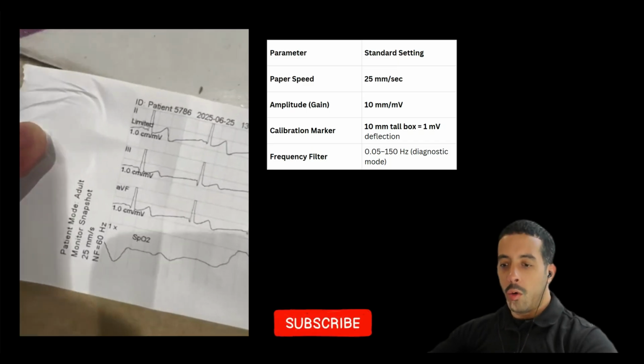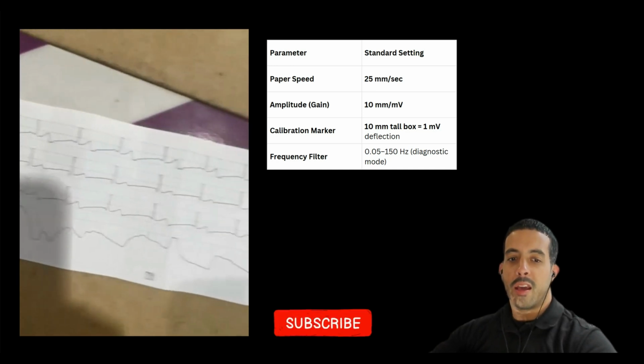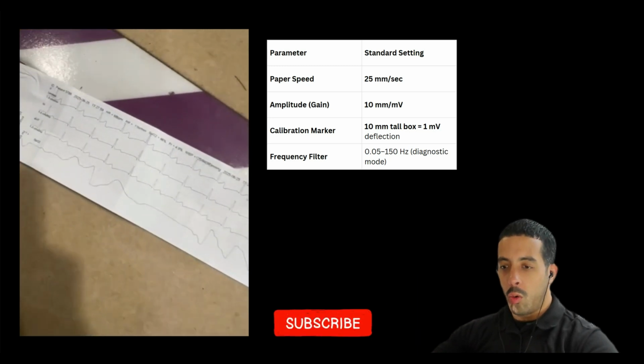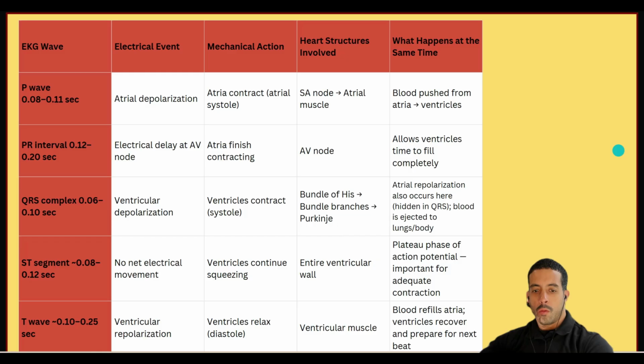Now, here's a video of an actual printout from an EKG. When you print out EKGs, make sure you reference this table on top of me so that you know exactly the calibration a monitor should be on to be considered accurate. All right, my people, I've created this table for you so that you can see that on EKG paper, there are many things going on simultaneously. It's not just a squiggly line on EKG paper.